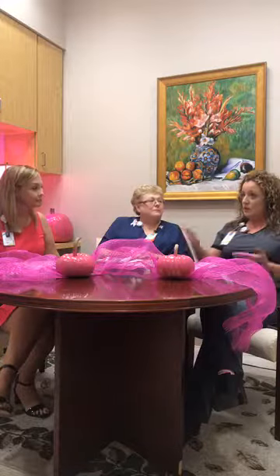But catching it early also comes with having your yearly mammogram, instead of every 3 years. When you have your yearly, they put your films up from last year and this year, and they're comparing. They're not just looking at your breast today, they're looking at your breast today compared to your breast 3 years ago or 2 years ago. Are there changes happening within your breast? Are those normal changes? And then that comes back to the diagnostic. You come in for your screening and, oh, this looks different. Let's verify that this is a normal change. They bring you back, they'll do spot compressions, or they'll do mag views or something along that line to verify that what's changing in your breast is a normal change.